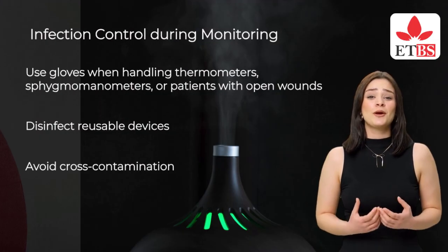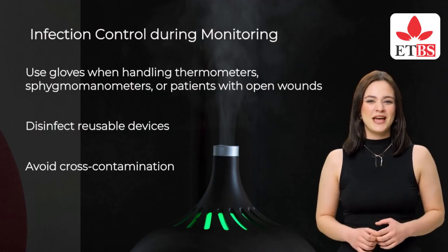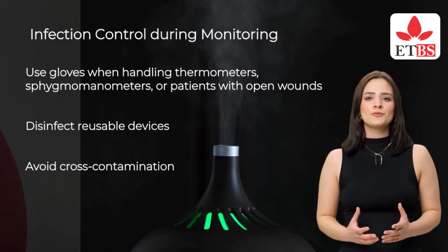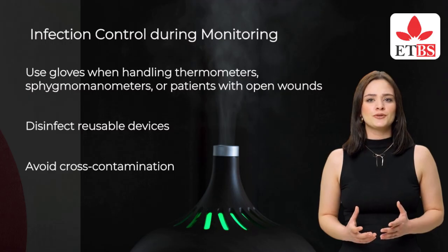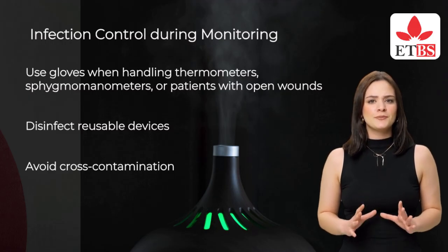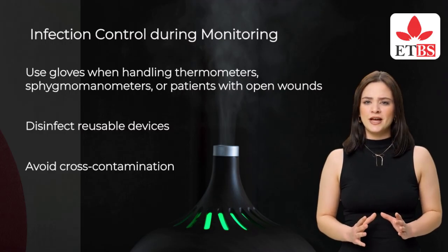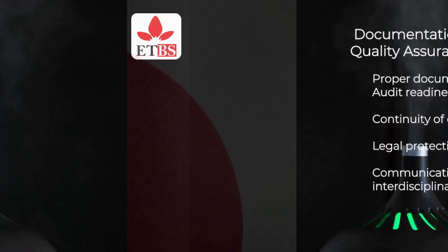Infection control during monitoring. Use gloves when handling thermometers, sphygmomanometers, or patients with open wounds. Disinfect reusable devices. Avoid cross-contamination. Dispose of sharps correctly. Hand hygiene before and after all procedures.